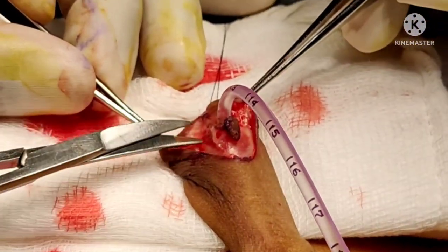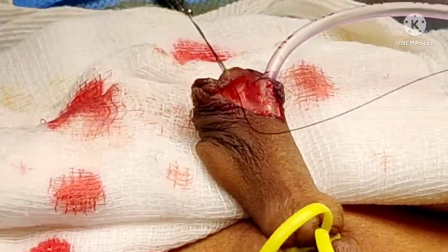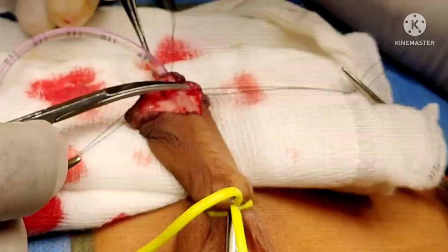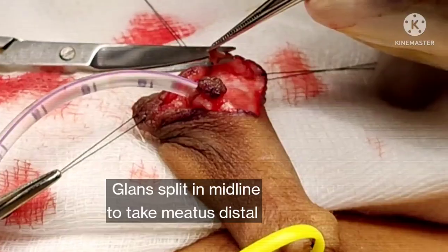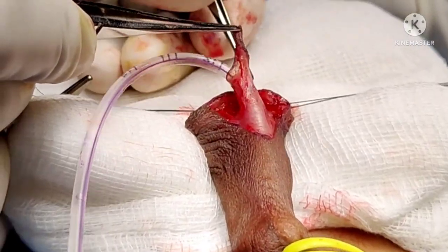Once we know that this is the case, we release the urethra from the glans attachments and also the glans base. Once the urethra is lifted off the glans, we also mobilize the urethra dorsally. We now split the glans in the midline and then do some glans sculpting to create a space for the meatus to be placed.